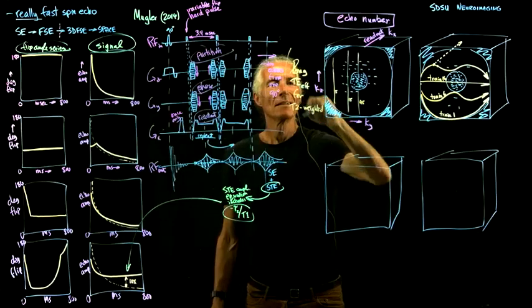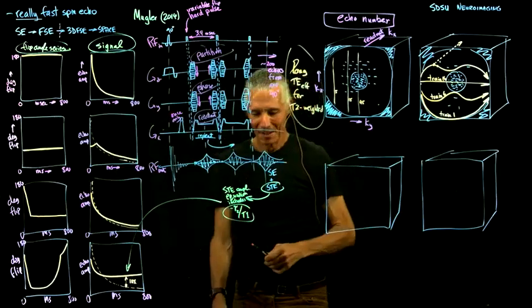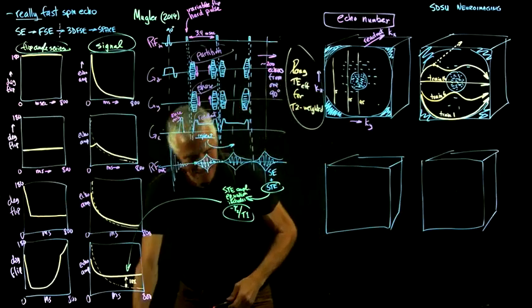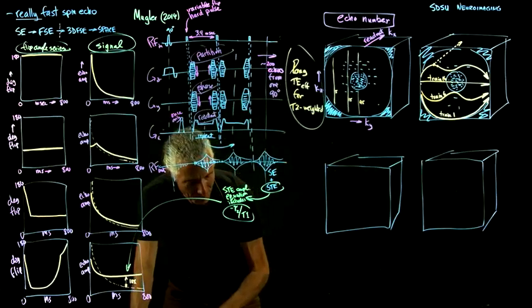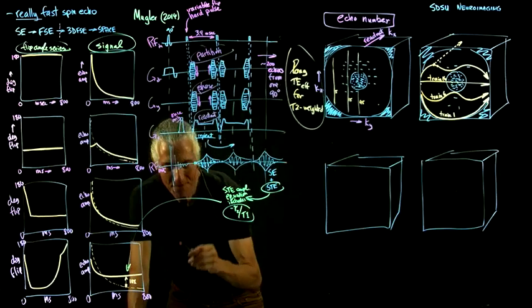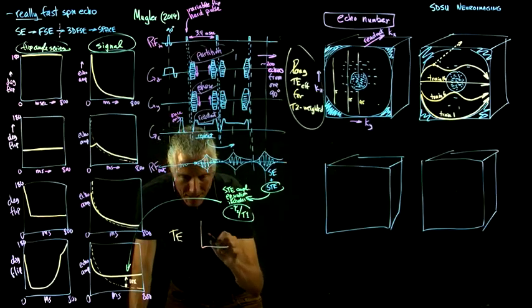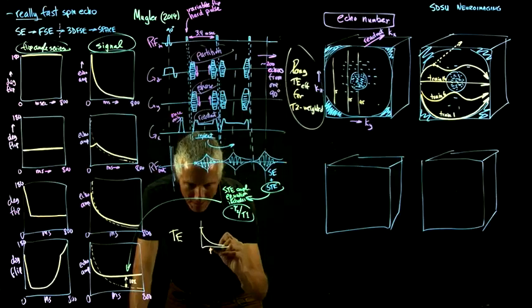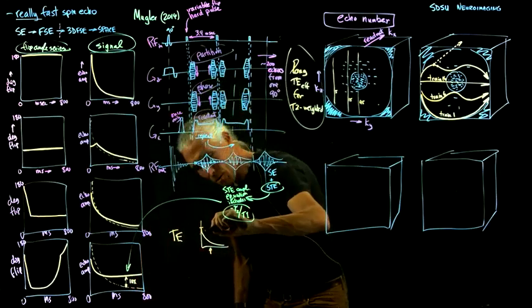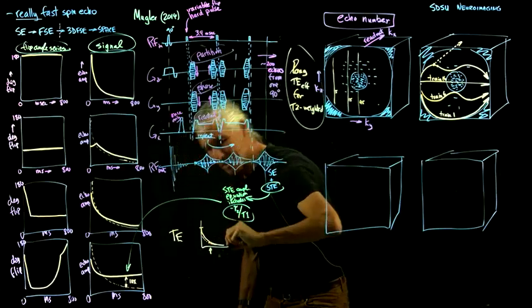And this is sort of like doubly TE effective. So we started off with TE. So what is TE? TE was we record the signal at some point right here, and we hopefully get a contrast difference between the two.